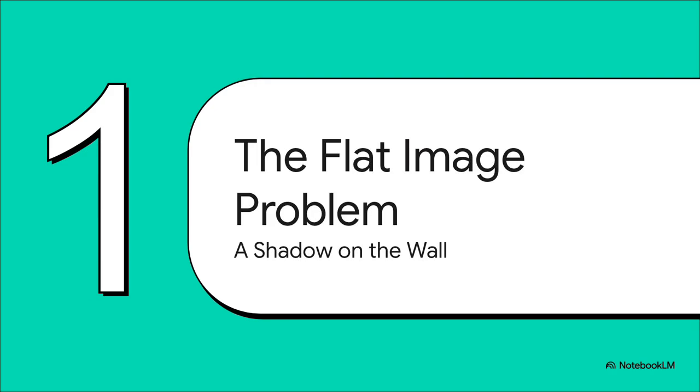This gets us to the core challenge, what we call the flat image problem. See, a radiograph is just a 2D image of a 3D object. Think of it like this. It's like trying to figure out how far apart two people are standing just by looking at their overlapping shadows on a wall. It's tricky.